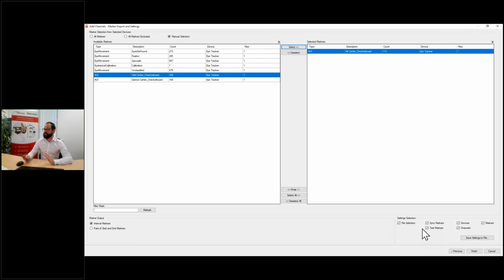This is quite nice if you want to work very regularly with the same type of file, with the same stuff inside, not just in this Analyzer workspace, but also in other workspaces or on other computers, or maybe your colleague is doing another study with the same type of data files. If we always import the same stuff and use the same parameters, save it into a file, and then you can reuse it in a different workspace. So this is again very practical for automation.